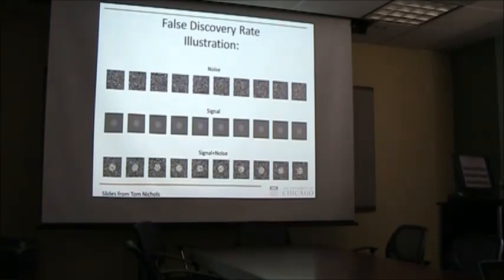So suppose you have just images with pure noise, like randomly distributed noise. And you have here images with signal. So in the middle there's some signal, these brighter spots. If you add these two, and again this is two-dimensional, your actual fMRI image would be three-dimensional, just for this example it's a two-dimensional image, you get an image that has some signal here in the middle and some noise outside. Does that make sense?